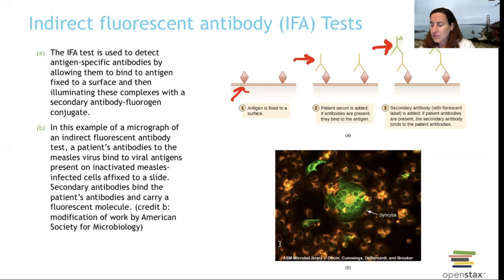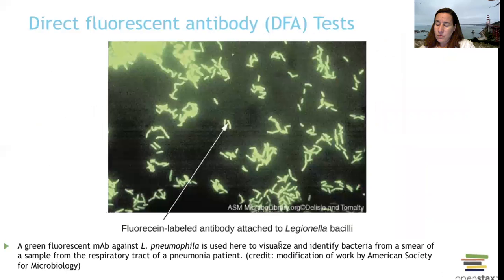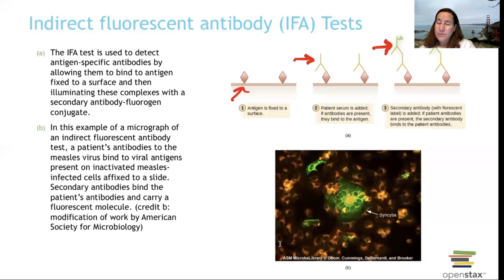Again, these are really helpful on bacteria that don't culture well and that you need to use a live one for, like Legionella. Or if you think a patient has been infected with something and they've got the antibodies against it and you want to test their serum to see if they've got the antibodies. Maybe they had it, but they don't have it right now and you need to know if they've got the antibodies that are still in their system. You do use an indirect fluorescent antibody.